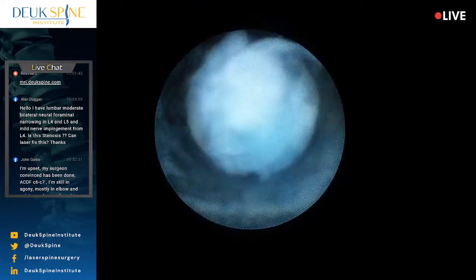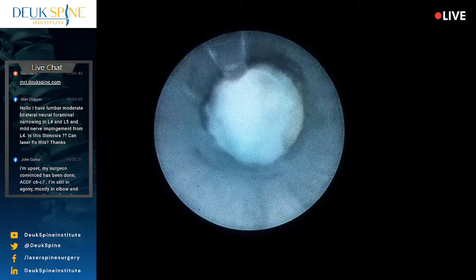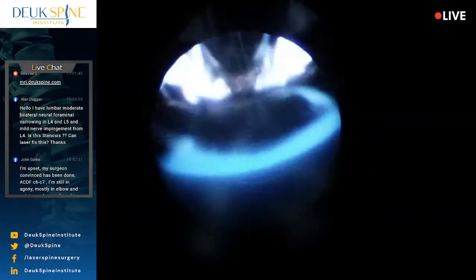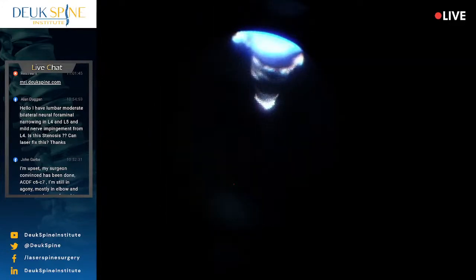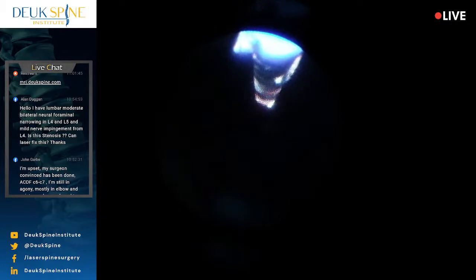Oh, look at that herniation. I love it. Come to Papa. It's like a little roach just sitting down there wanting to be loved. We're going to take it out. We're going to give it an Apgar score. Oh, it's too big. Doesn't want to come out. There it is.